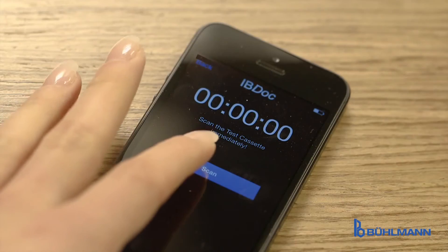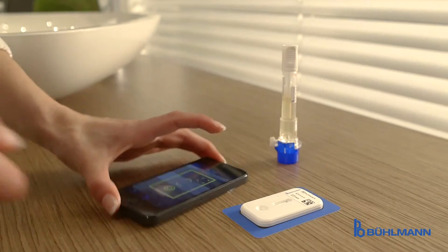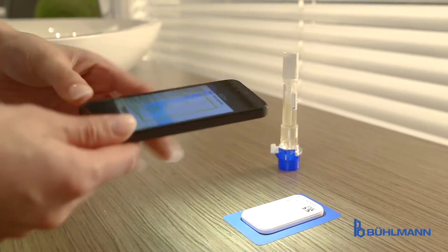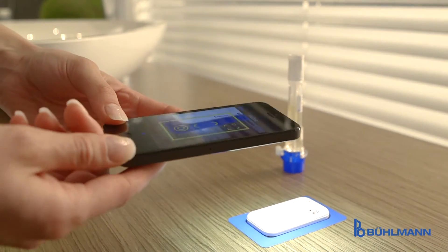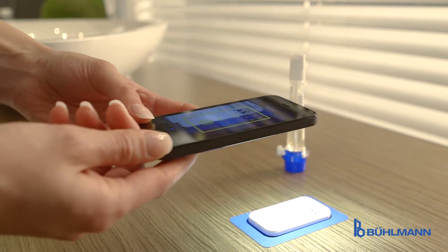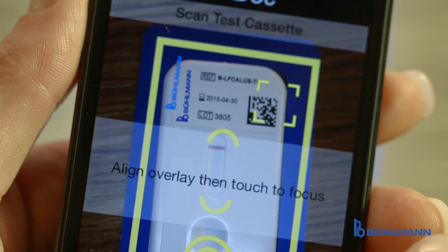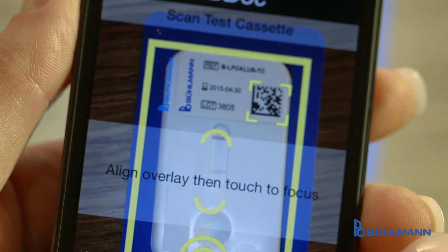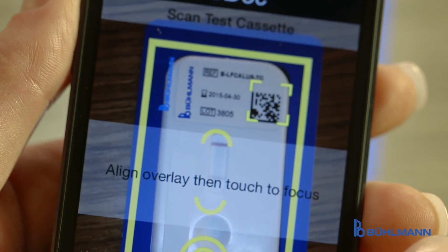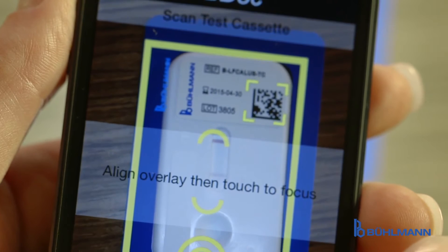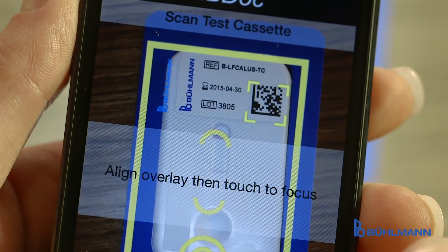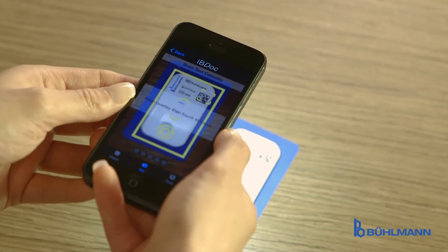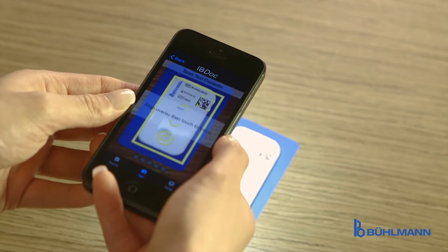The next IBDoc step is the generation of a result picture. To scan the result, the camera is placed above the cassette. The overlay is focused and the picture is automatically taken.